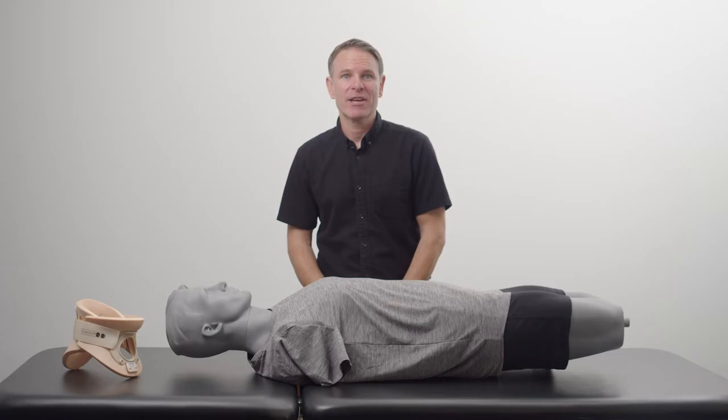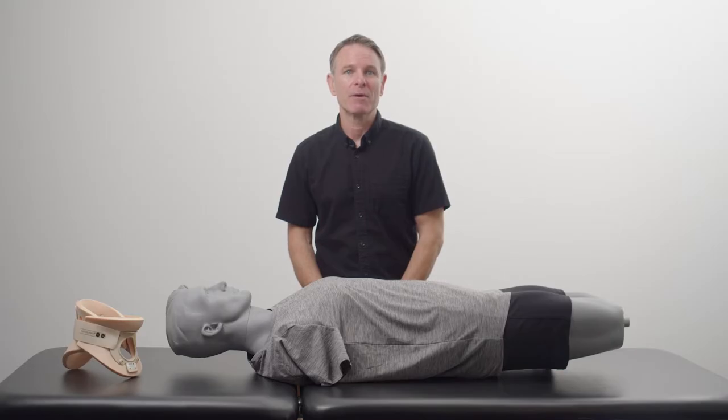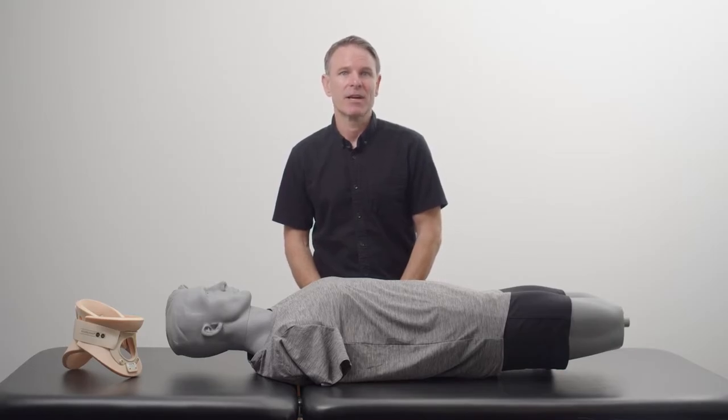This is the Philadelphia Tracheotomy Collar Practitioner Fitting and Skin Care video. This video is designed to guide you with the proper fitting, removal of the collar for skin checks, and cleaning recommendations.